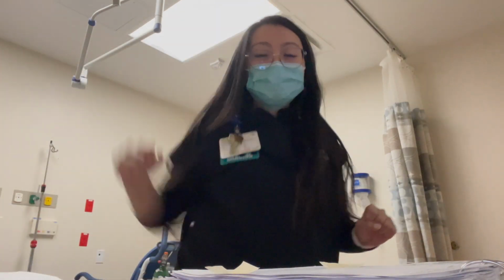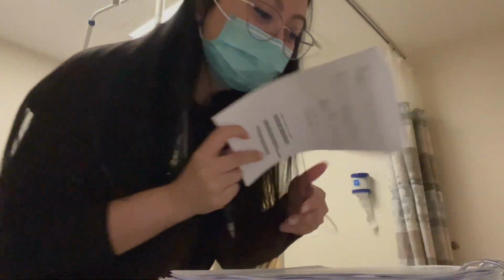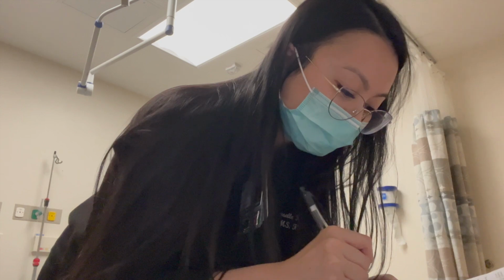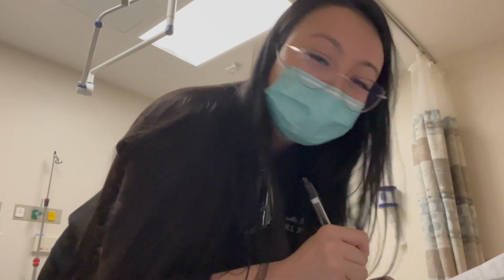My shoulder, it's a good thing I do stretches because that could really kill my arm and my shoulder. Congratulations to all the pregnant people today. That's a lot of people pregnant. Lots of vaginal ultrasounds there. Hopefully I'm done with vaginal exams today. The next patient I'm getting is a leg. And she's definitely not pregnant.